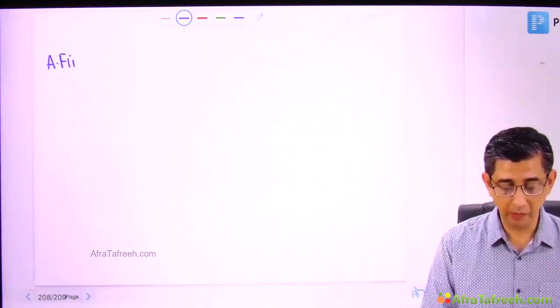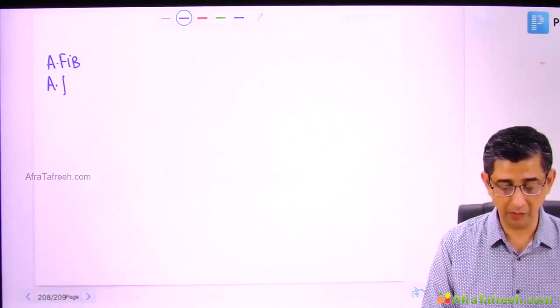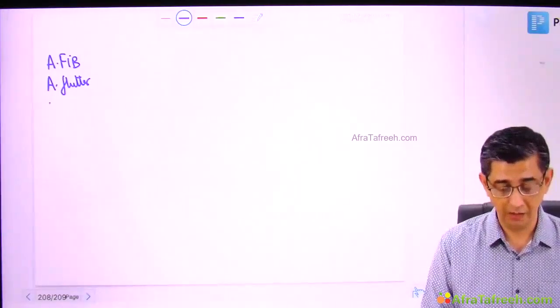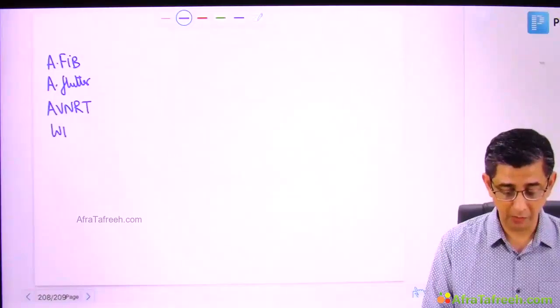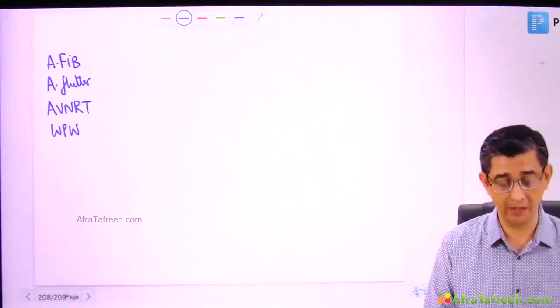I will be talking about ECG findings with respect to atrial fibrillation. Then we will talk about atrial flutter. The minor aspects obviously need to be taken care of. Then is AV nodal reentrant tachycardia, which is also referred to as PSVT. I will speak about Wolff-Parkinson-White syndrome, that will be having an antegrade as well as a retrograde conduction.